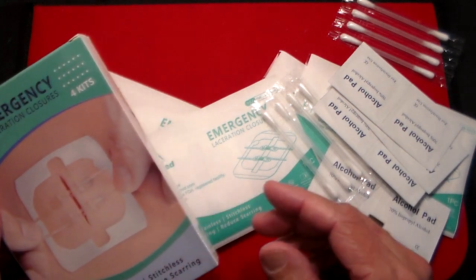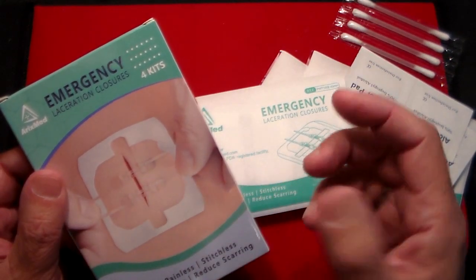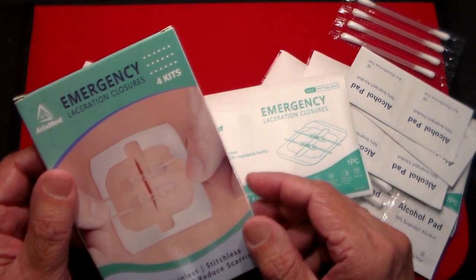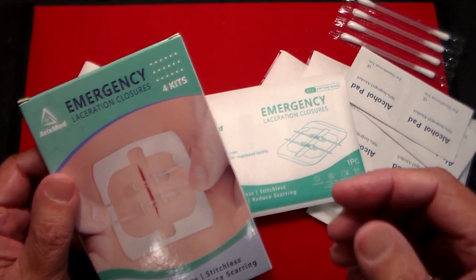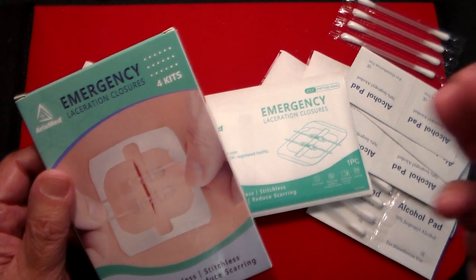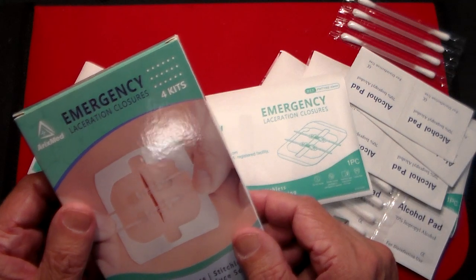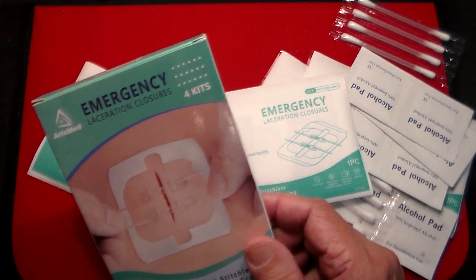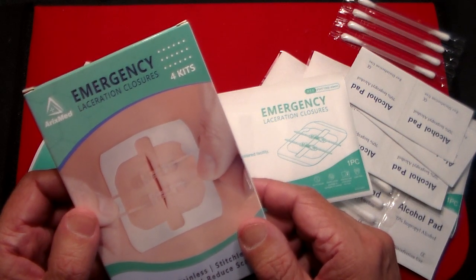This is a kit that comes with four different packages, and as you can see by the picture here, it's designed to use in an emergency to close up a cut. So instead of gluing the cut like some people do or even using staples, this is something that you could do at home, if you're traveling, if you have an RV and you're in a place where there isn't an emergency center. You could use this at work if you do something slightly dangerous, for sporting events, or if you have little children or grandchildren that are always cutting themselves. It's a good thing to have.